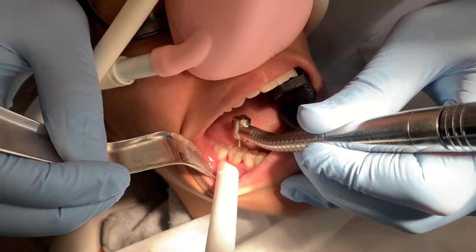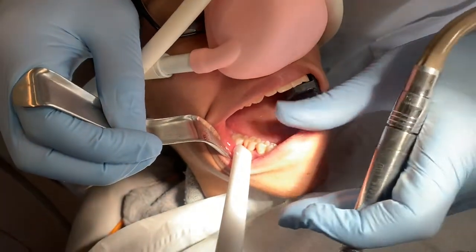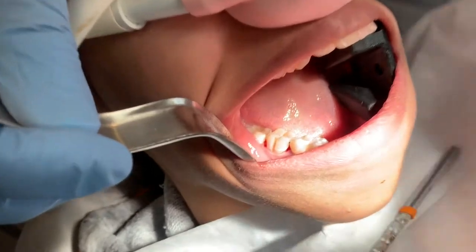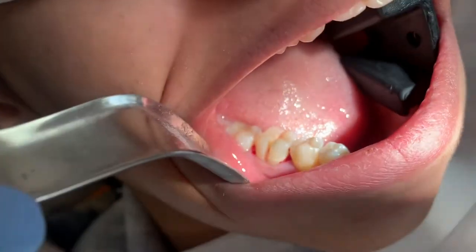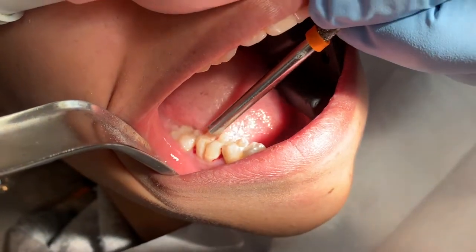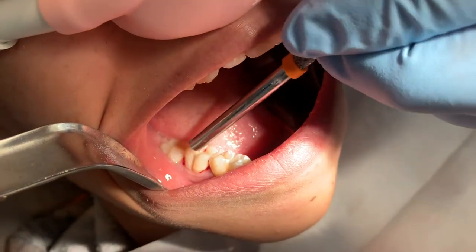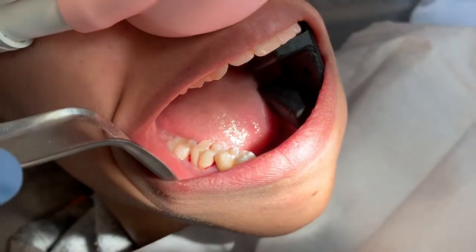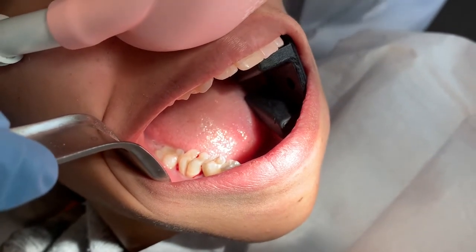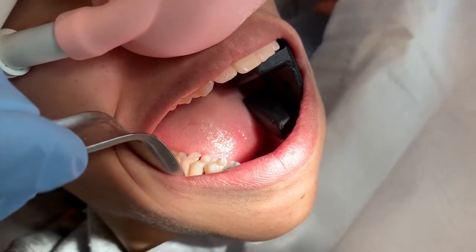It's really easy to tell if the tooth is alive at all anymore. Here, go ahead and take that away. If you look down in the tooth, I don't know if you guys can see this, but this tooth actually still does have some living tissue in there. That is a lot of blood for a tooth. It's only a few pinpricks worth, but this tooth has probably been hurting for a while. And these teeth will have three or four nerves in them. And the truth of the matter is, there's probably one or two that's dead and another one that's alive.